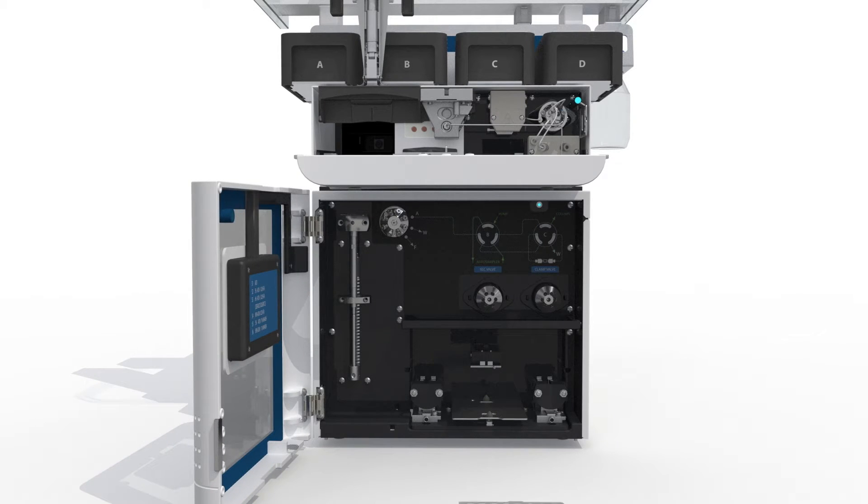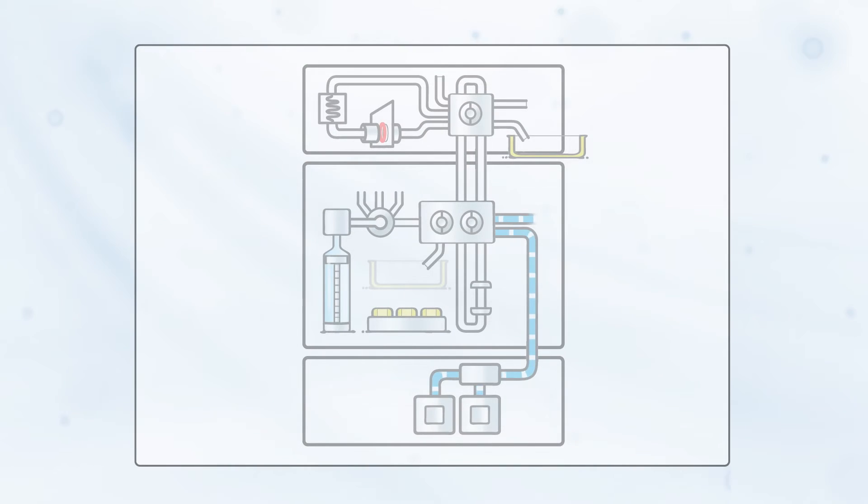A new tray with SPE cartridges for online sample cleanup is put into place and the system is ready for desorption and analysis of the bloodspot. Now, let's follow the blood sample on its way from dried spot to analytical result.